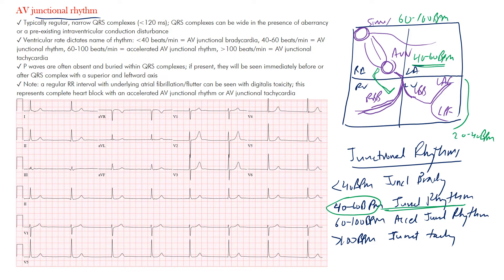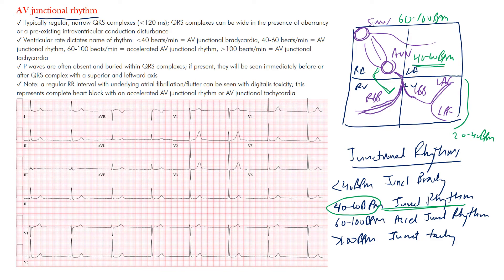A junctional rhythm typically has a regular, narrow QRS complex less than 120 milliseconds — that's less than three small boxes on the EKG. The QRS width is measured from beginning to end. It could be wider if there is aberrant conduction or a pre-existing intraventricular conduction delay affecting the lower pathway.